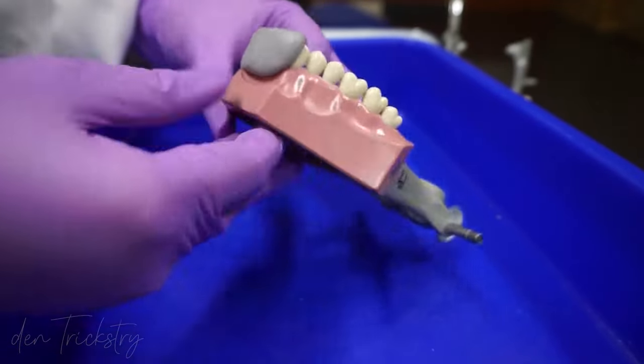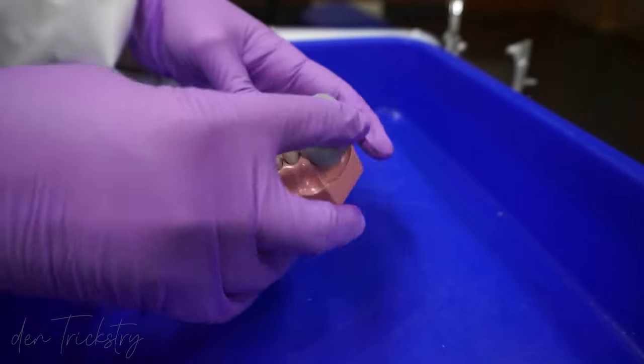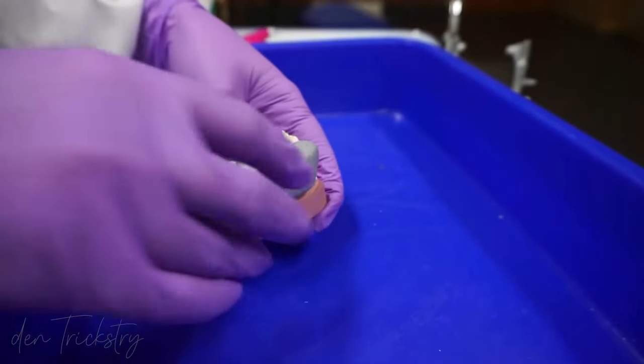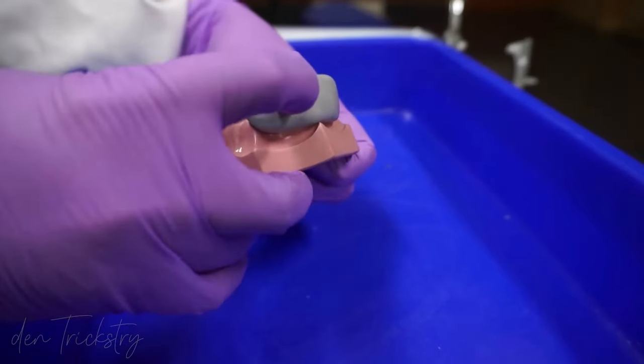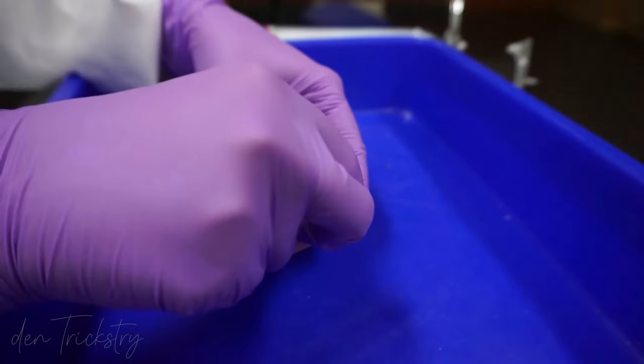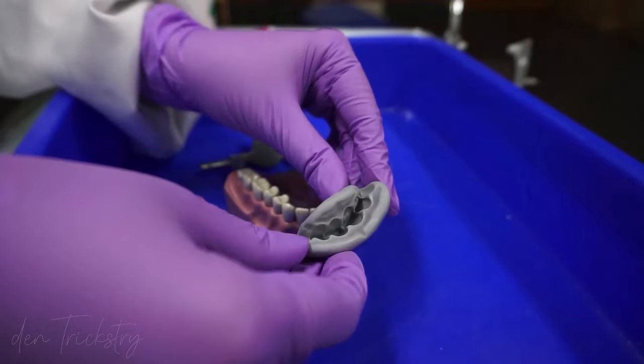Gently press the material all over on the labial, palatal and occlusal surfaces so that our area of interest is captured accurately in the index. Let the material set, confirm that there is no indentation on the putty. Once set, remove the index and inspect that all the teeth have been captured properly.